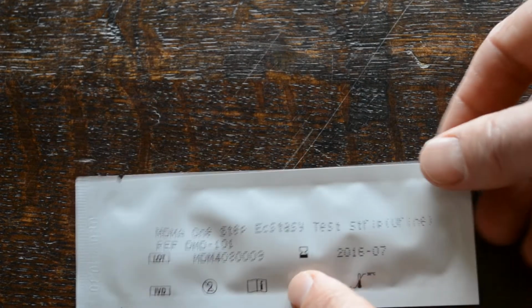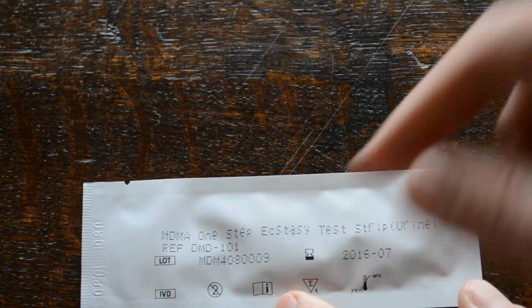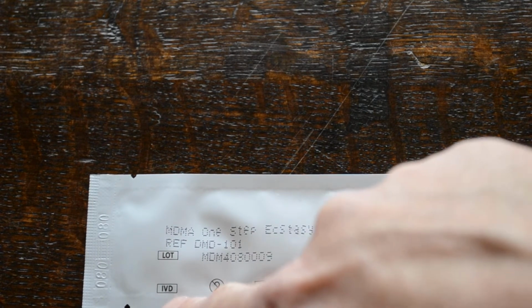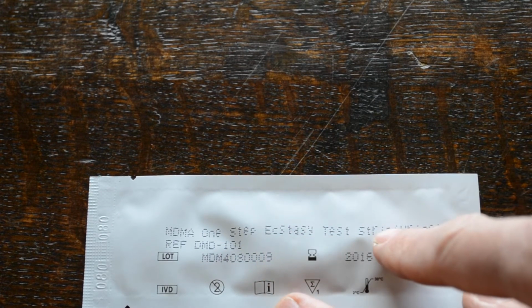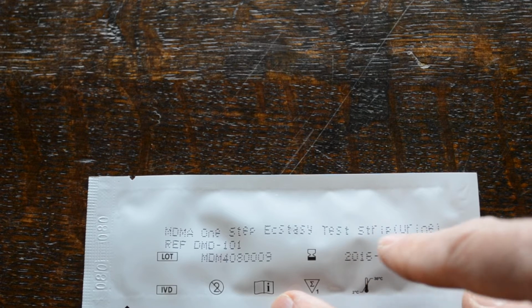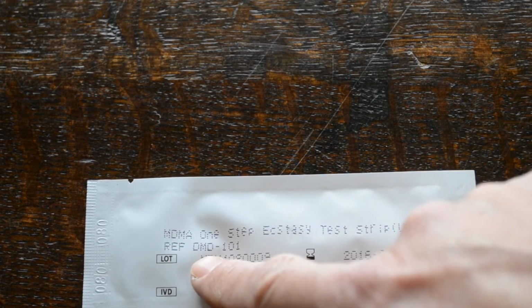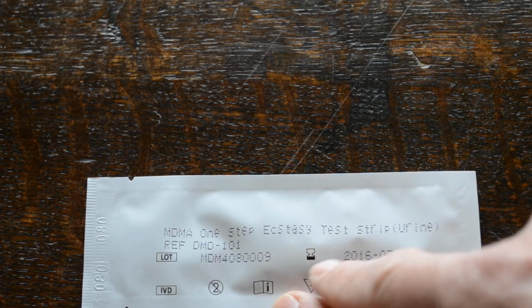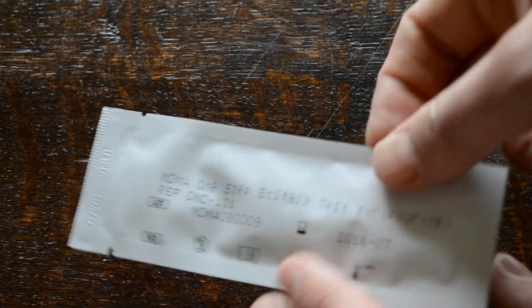On the reverse of the foils will be your basic IVD data showing storage parameters, that it's in vitro diagnostic and CE marked. It will also have details of what the test strip actually contains, in this case MDMA, one-step ecstasy test strip for urine, and the catalogue reference code for this is DMD101. It will also have the batch or lot number and the expiry dates on here.